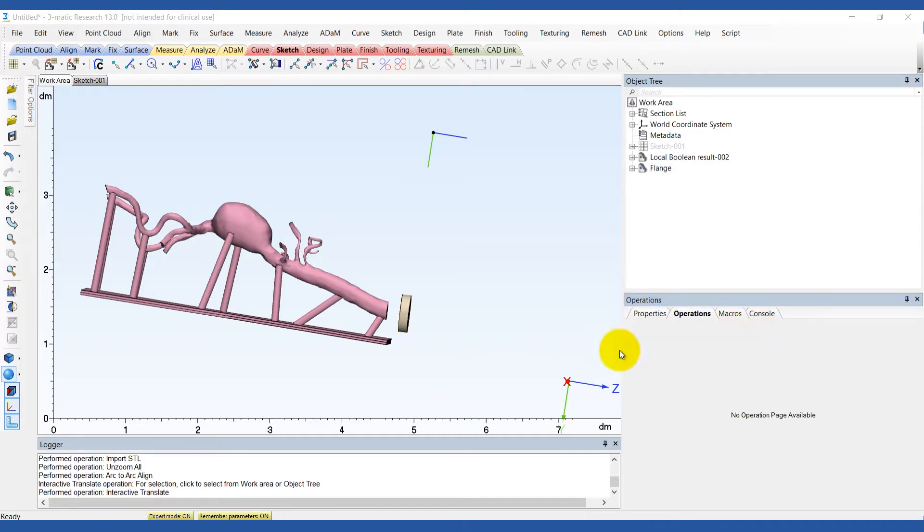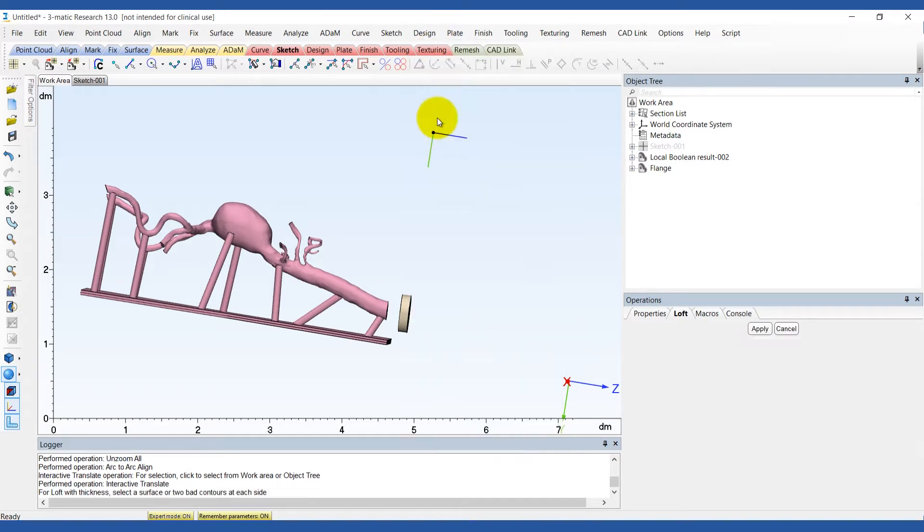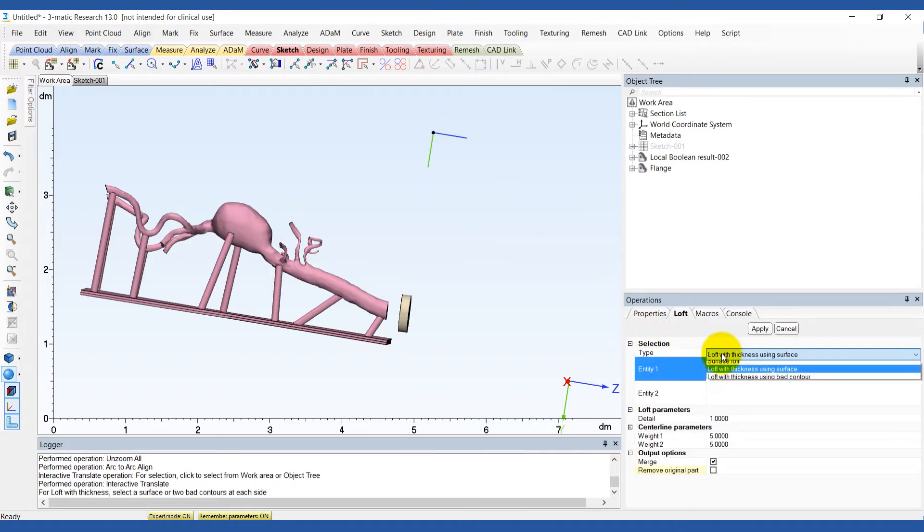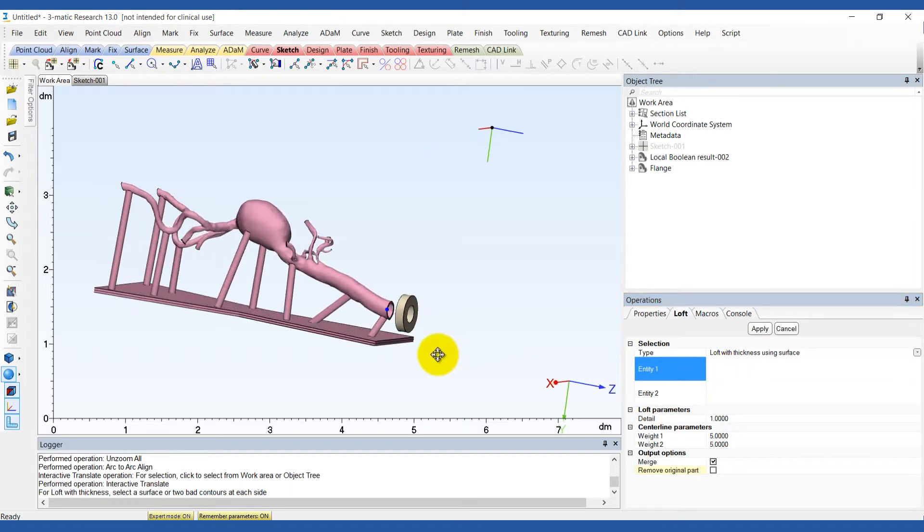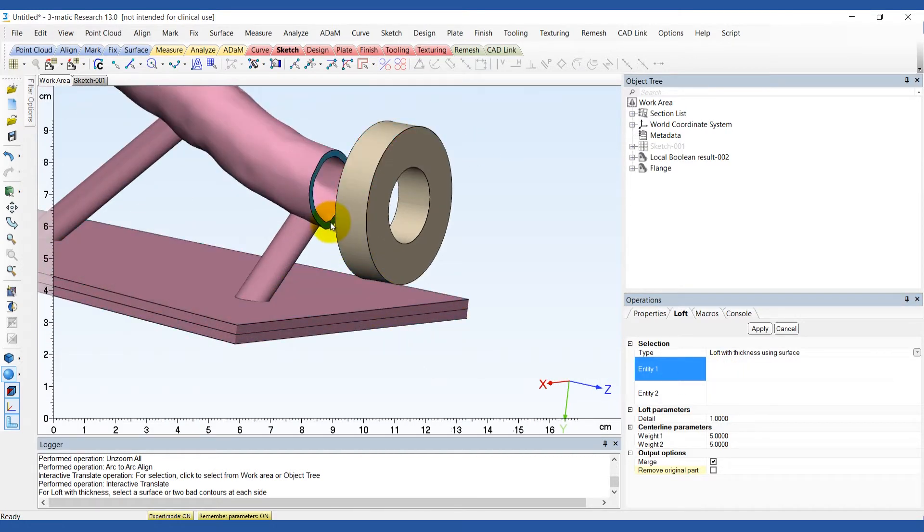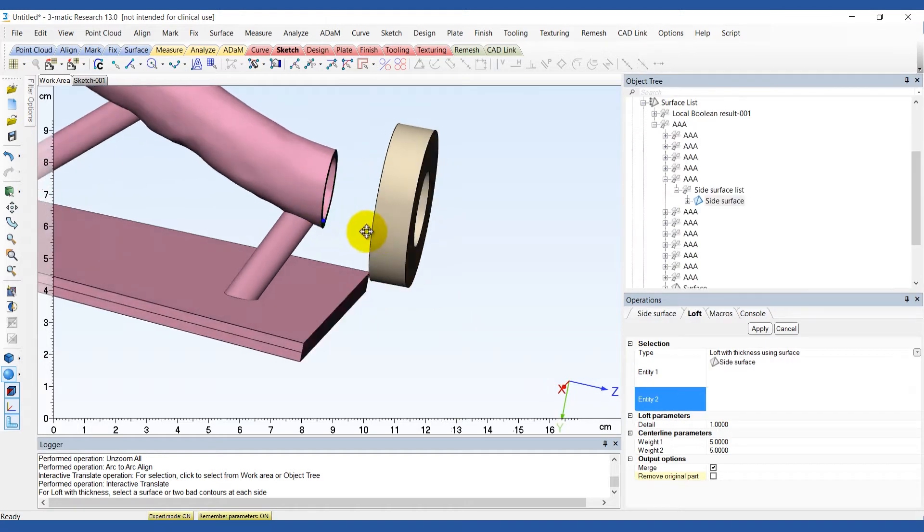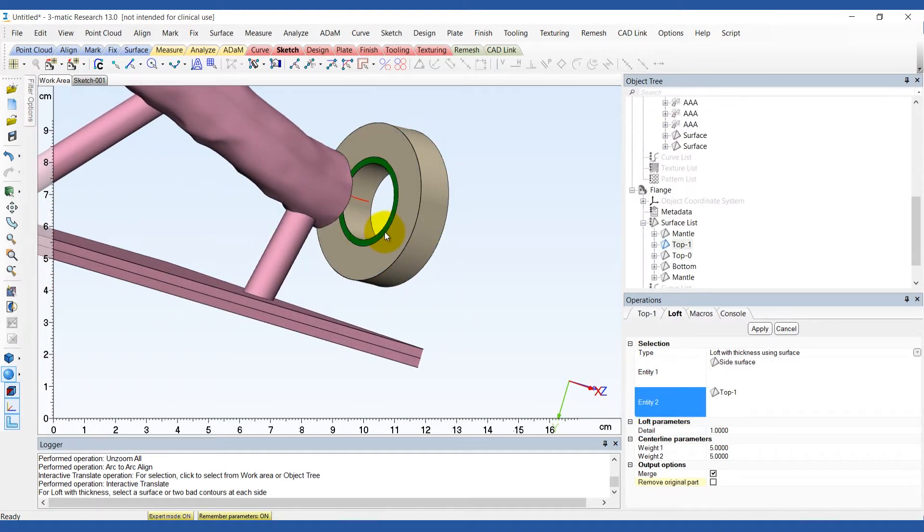Using the loft tool in the design menu, the flange can be attached smoothly to the aneurysm model. Choose loft with thickness using surface as the method and select the side surfaces of the two parts. Use the default settings and select option merge.